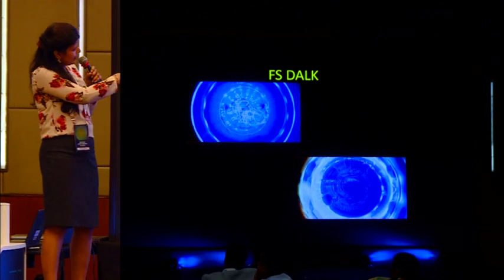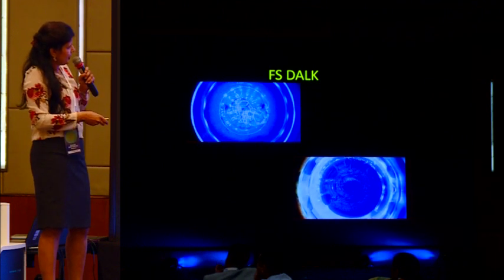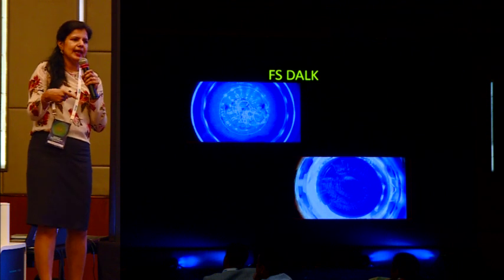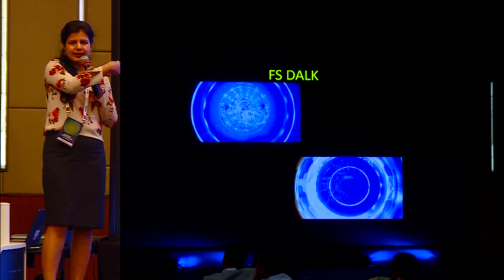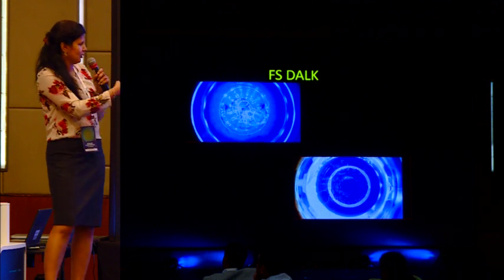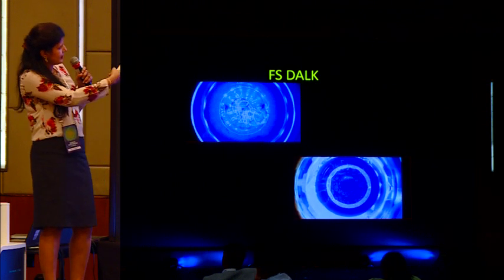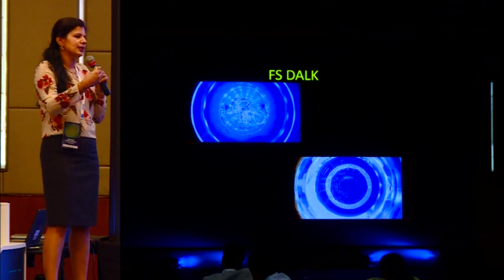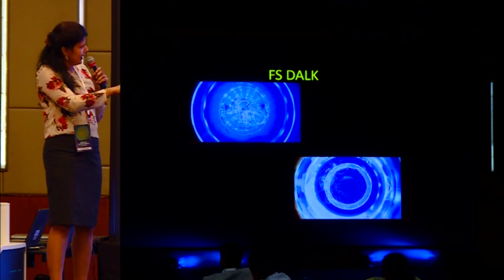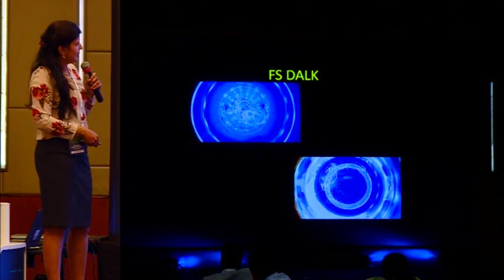Over here on the recipient cornea, you can see that you need to fit both the suction ring and the applanation PI, unlike only the applanation cone that you fit for the donor cornea. Again, it cuts in a similar fashion, but to a lesser depth than what you did for the donor cornea. And those bubbles you see there are underneath the PI.